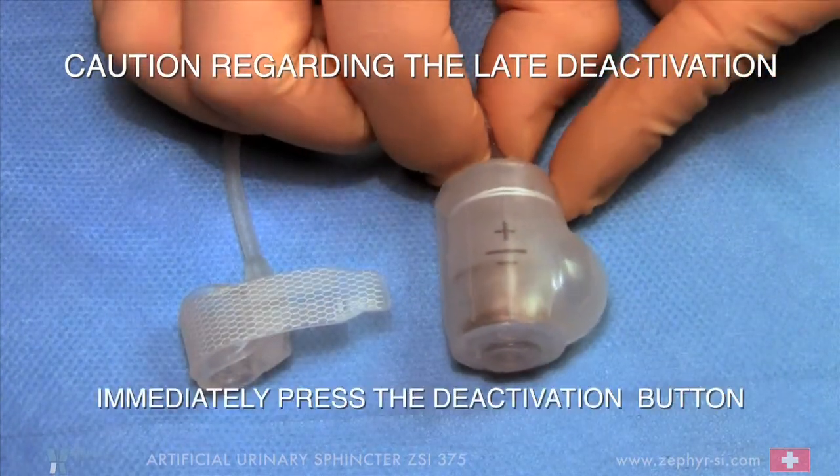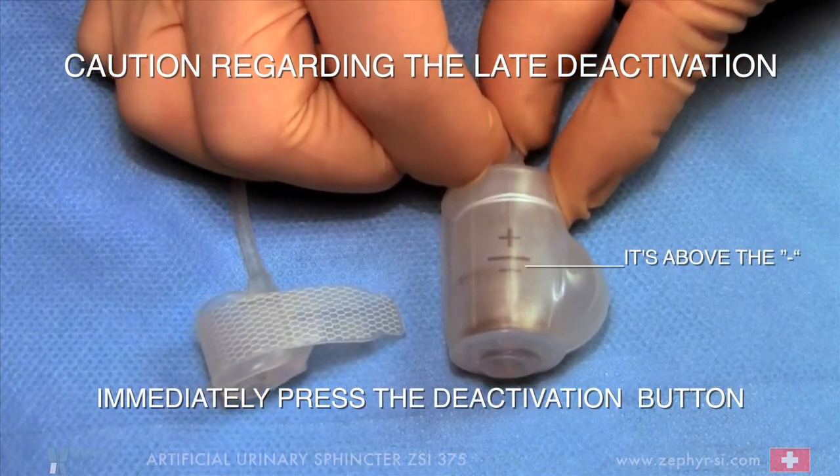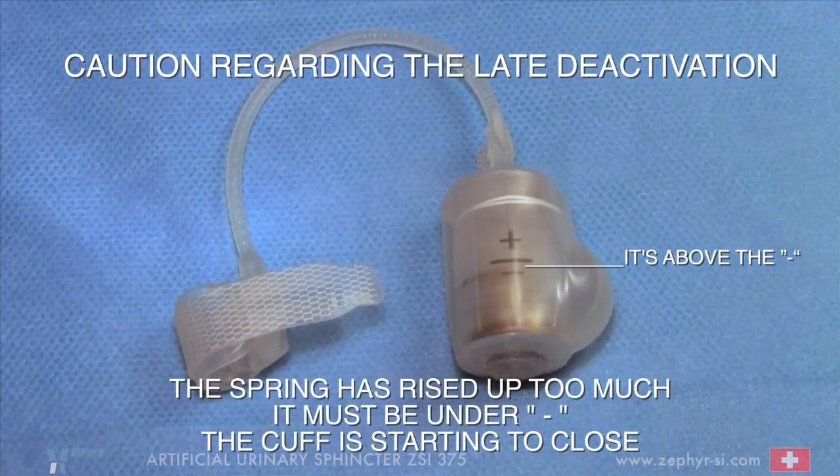Immediately press the deactivation button. It's above the minus. The spring has risen up too much — it must be under minus. The cuff is starting to close.